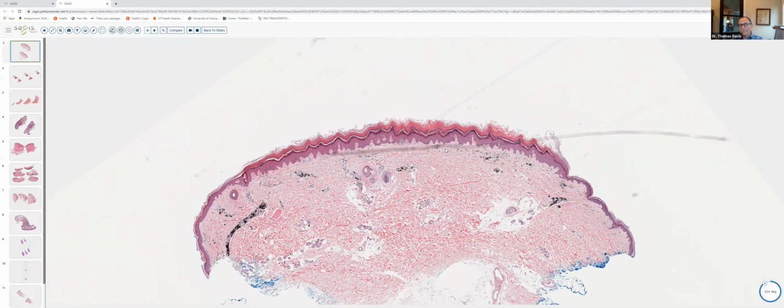That being said, it's an excellent hemostatic agent. I think in many instances it actually works better than aluminum chloride, but because of its tendency to produce more of an inflammatory response and to tattoo the skin, it's not used quite as often. And you can imagine, because this is an iron-containing compound, it will light up like a Christmas tree. If you threw a Perls or other iron stain on it, it would stain very, very bright blue. So this is Monsel's, and I would definitely familiarize yourself with what Monsel's and aluminum chloride look like under the microscope.